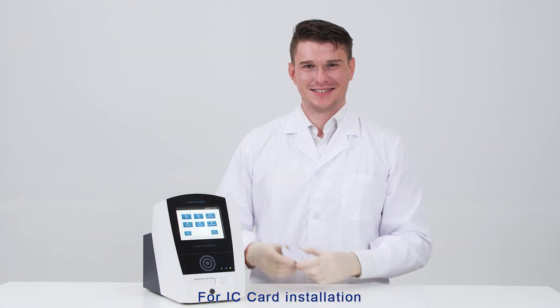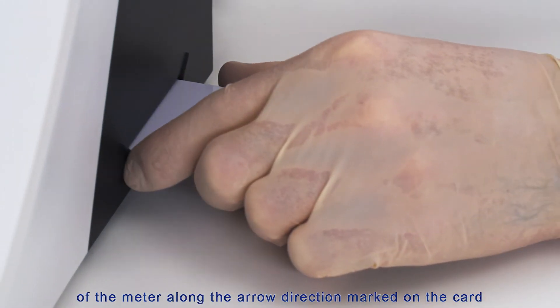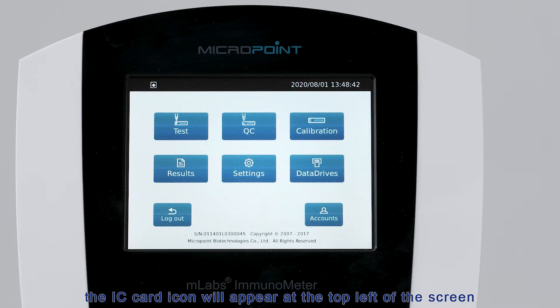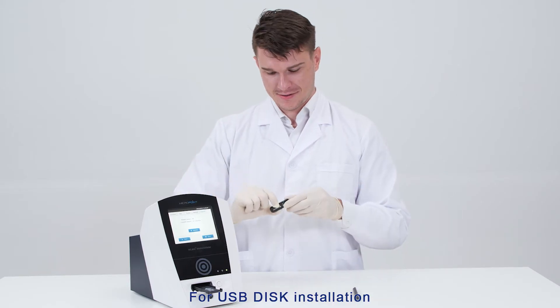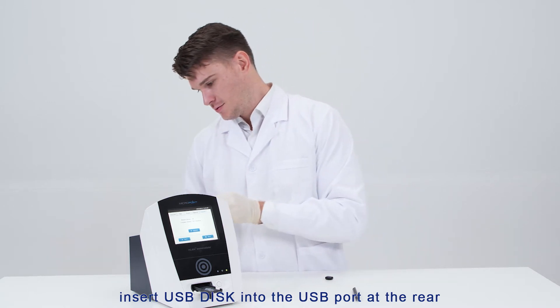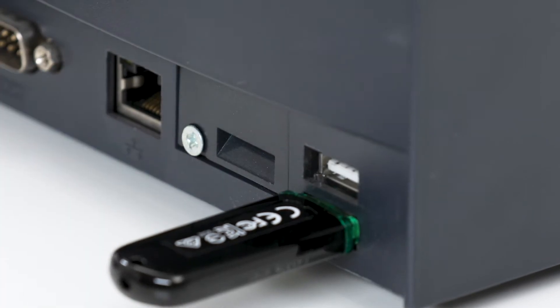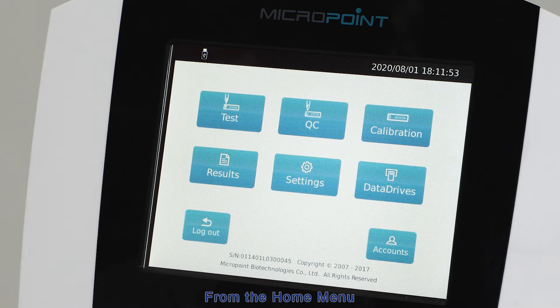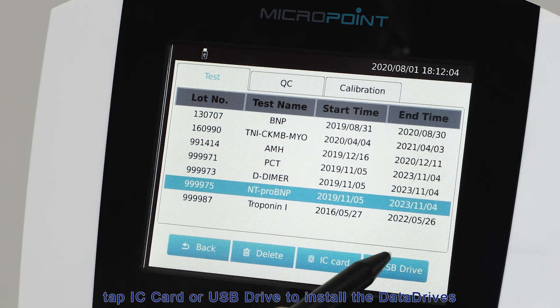For IC card installation, insert the IC card into the slot on the right side of the meter along the arrow direction marked on the card. When the IC card is properly inserted, the IC card icon will appear at the top left of the screen. For USB disk installation, insert the USB disk into the USB port at the rear of the M-Labs Immunometer — the USB icon will appear at the top of the screen. From the home menu, select Data Drives, then tap IC card or USB drive to install the data drives.